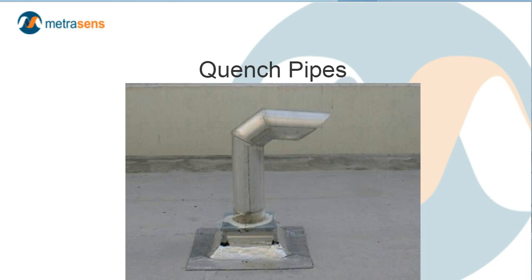Wind-driven rain can actually force its way into the end of the pipe if the wind is blowing in the right direction. You really want one that prevents even horizontally driven rain from entering the end of the quench pipe. But this is just an example of what one may look like on the roof of a hospital building or an imaging center. Sometimes they come out the sidewall, but this is just a discharge end of the quench pipe for your edification.